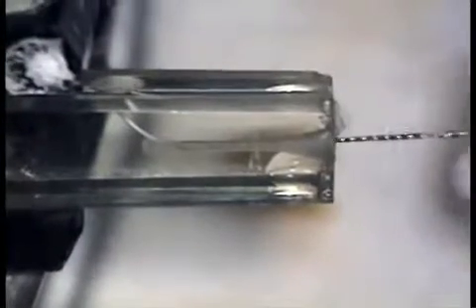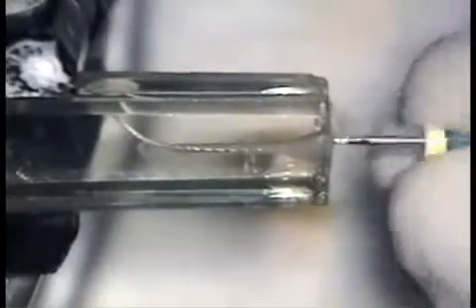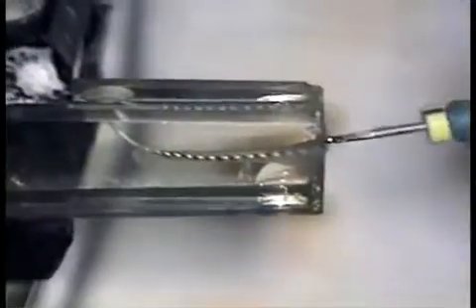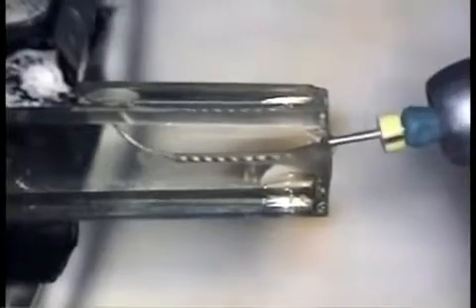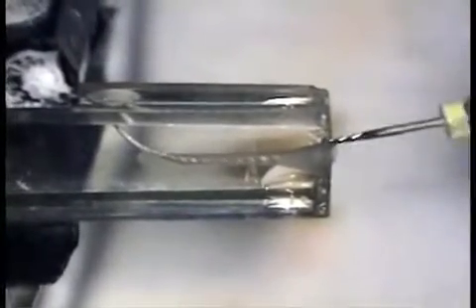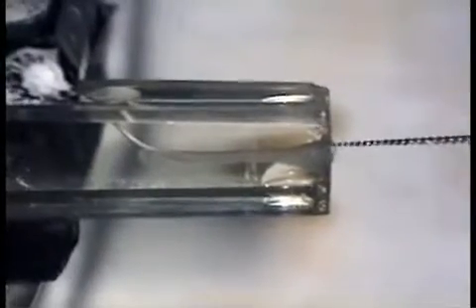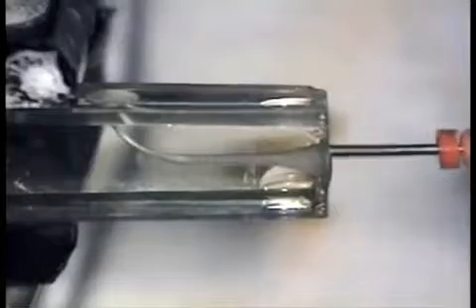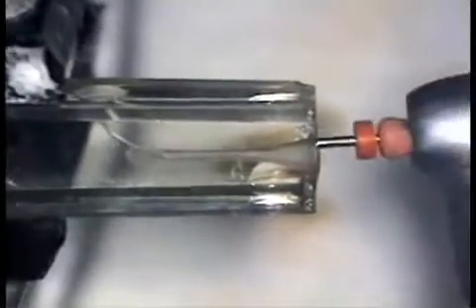I follow up with the 35 relieved reamer used first manually and then refine the shape with the 35 used in the reciprocating handpiece. With the maintenance of patency as a result of going 1 millimeter beyond the length of the block, the equivalence of a 1 millimeter extension beyond the constriction, distortion-free shaping is maintained through a 35. Please note how easily the 35 attains full length when the reciprocating handpiece is used.